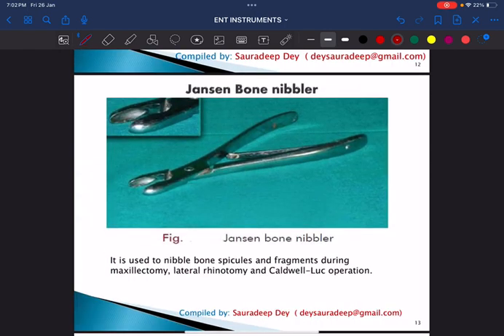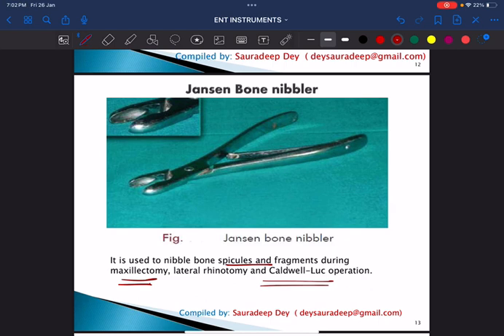This is Jansen's bone nibbler, used to pick up bone spicules and fragments, especially during maxillectomy or Caldwell-Luc operation. You can see a concavity or depression at the end, which helps to pick up the bone spicules.